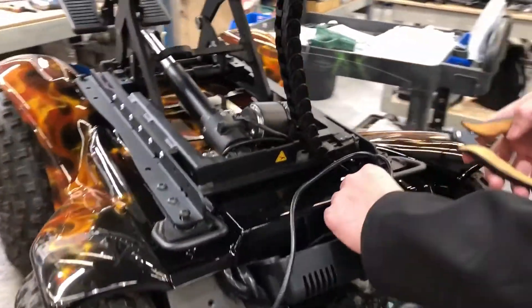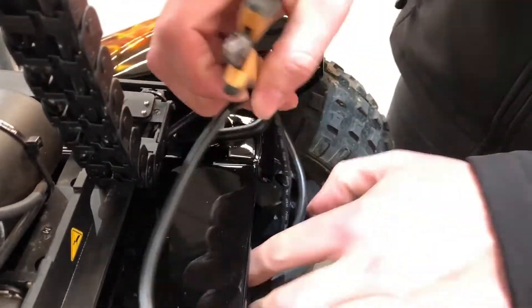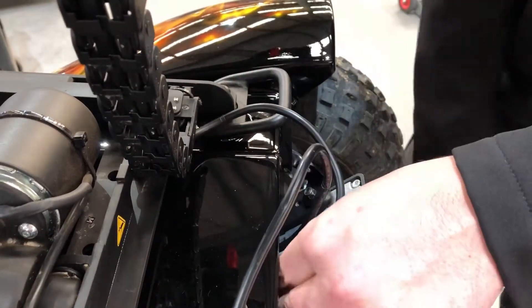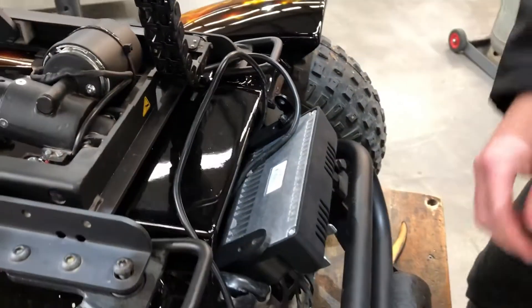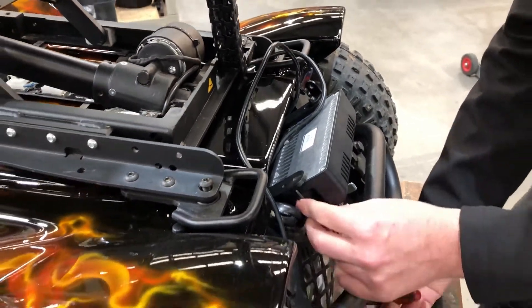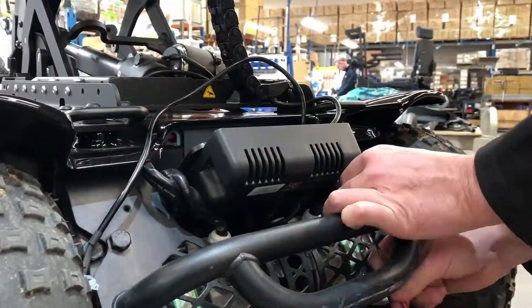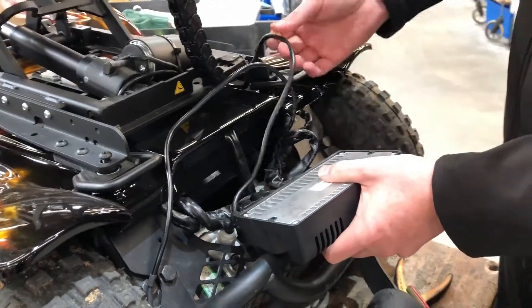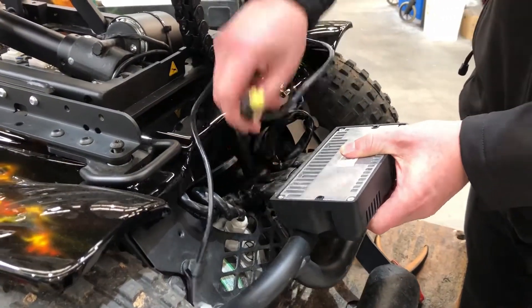The next step is to cut the zip ties holding the main wiring loom to the power module, and then undo the bolts holding the power module onto the chassis. This allows us to remove the power module and undo the other CAN lead from the power module and the seat unit.